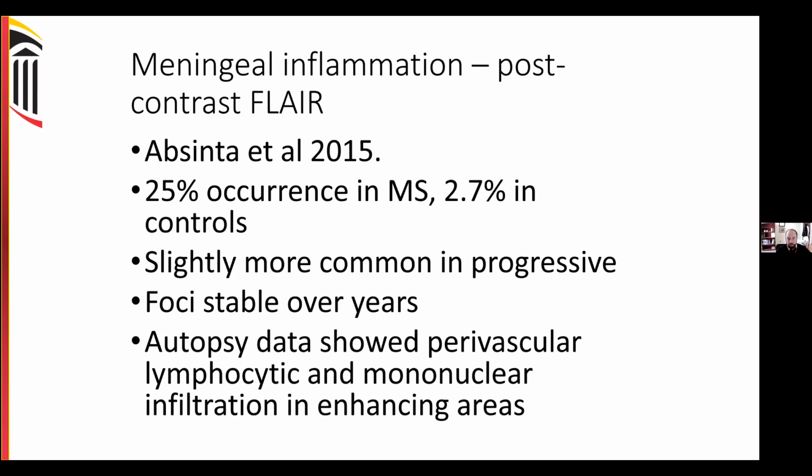They did have 2 subjects in their study who actually passed away, and they did autopsy work on those 2 subjects and showed that the areas that had been enhancing during the lifetime of those patients had perivascular lymphocytic and mononuclear infiltration, suggesting that, yeah, maybe actually this is related to meningeal pathology.